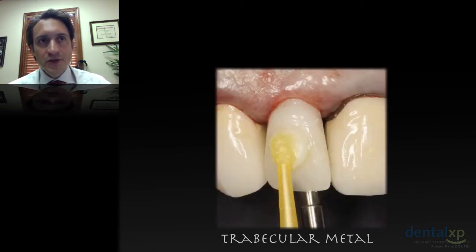And when I seat the provisional, the hollowed out denture tooth, you can see in this area, I am actually allowing for facial contour and support of the tissue. So I'm kind of putting facial pressure against this gingival margin. And you can see I've tried this in a number of times to make sure that I've got enough of the denture tooth cut away here so that I can allow for screw retention without having the incisal edge kicked too far buccal.